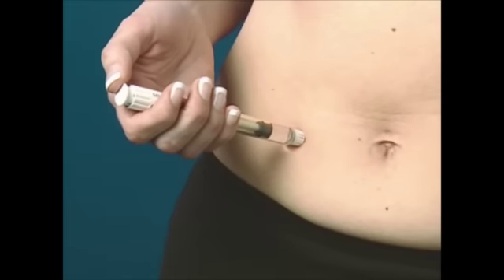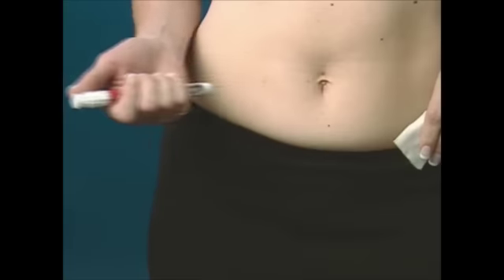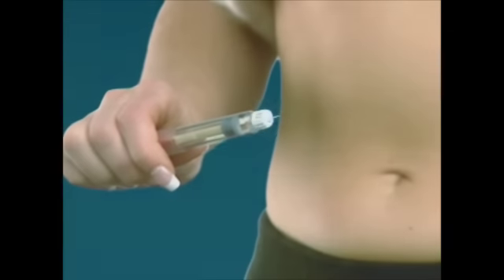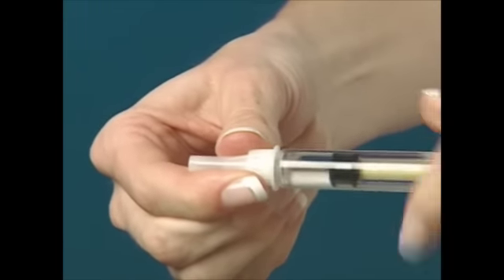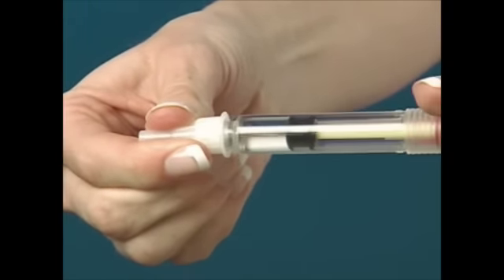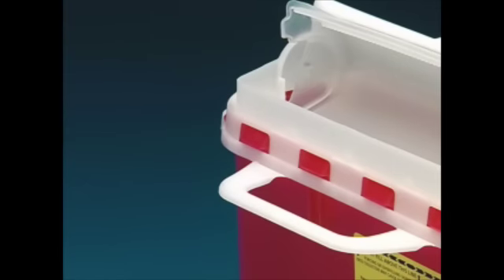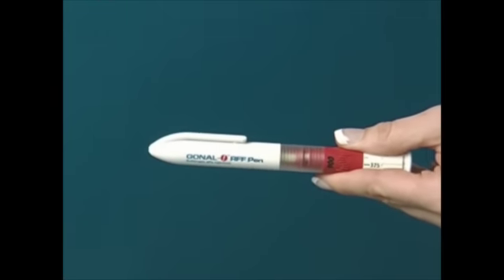Keep the needle in the skin for at least five seconds. Remove the needle and apply pressure as needed with a gauze pad. For disposal, hold the pen firmly by the drug reservoir and replace the outer needle cap. Grip the outer needle cap firmly and unscrew the pen from the needle by turning counter-clockwise. Dispose of the used needle in the safety container. Recap the Gonalef RFF pen.